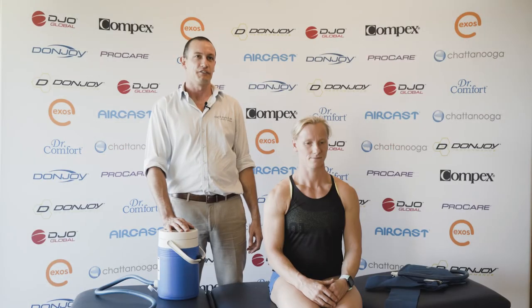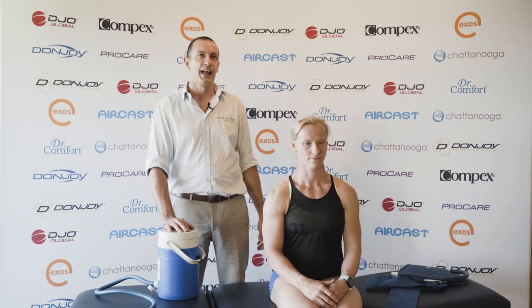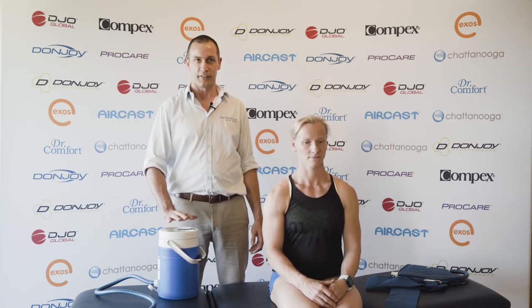Hi, I'm Ben Heath from Activate Physio, and joining me today I've got Helen Harding, CrossFit Games athlete. Today we're going to be taking a look at the cryo cuff.